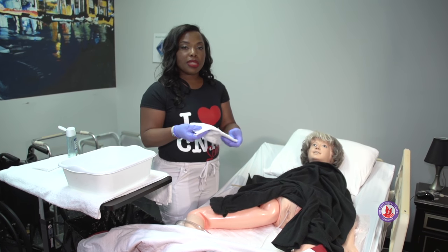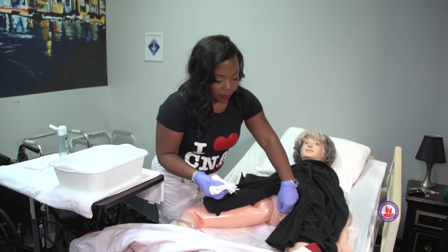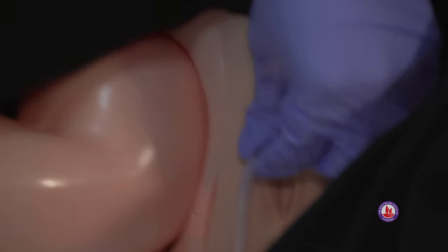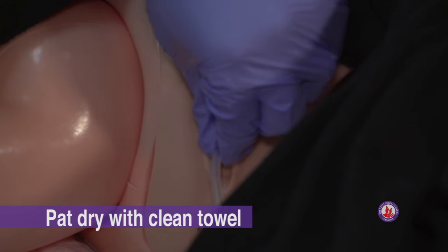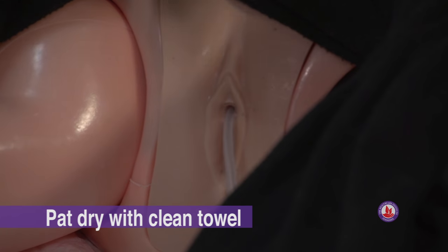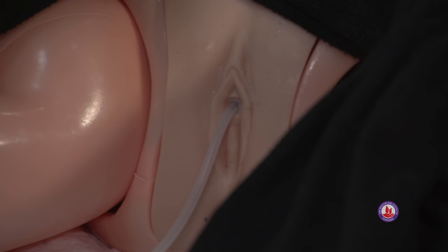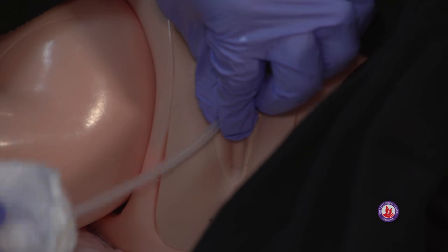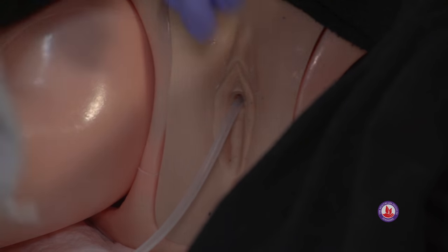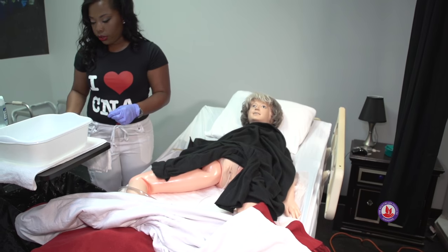Your last towel is going to be a dry towel to dry the area. Hold it one inch away from the urethra, pat dry around the meatus and down. Pull back one flap and pat dry. Another flap and pat dry, and one more. Discard that into the linen basket.